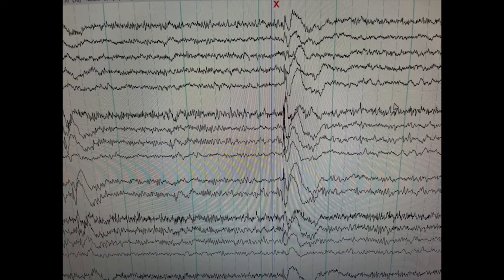At the end of the day I come back and hook up the patient — they're more relaxed at this time. I think they had a muscle relaxer in their medication, so that may have helped. I get all the wires on and start to run it. I'm thinking this is just going to be a run-of-the-mill EEG, probably not going to see too much, but while running it I see these spikes with a slow wave after them. It doesn't happen too often, so I just mark an X on it.